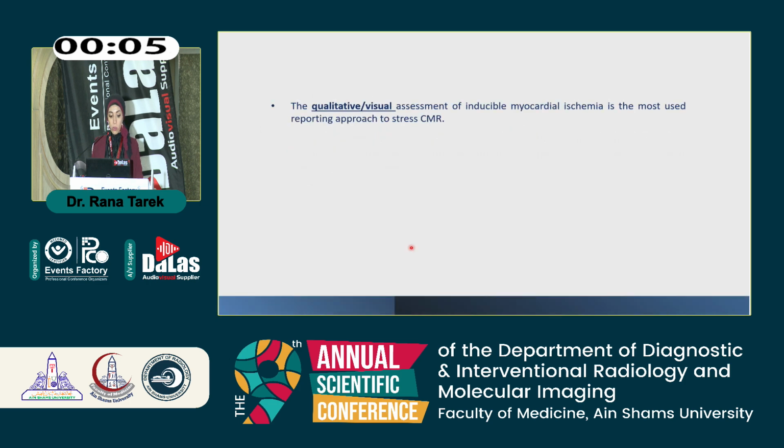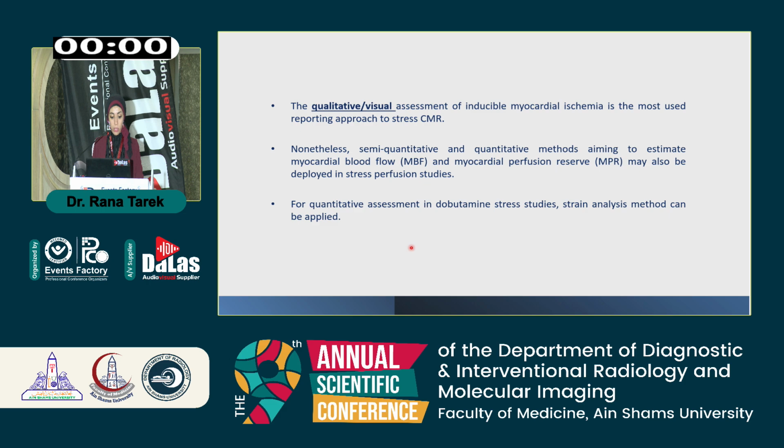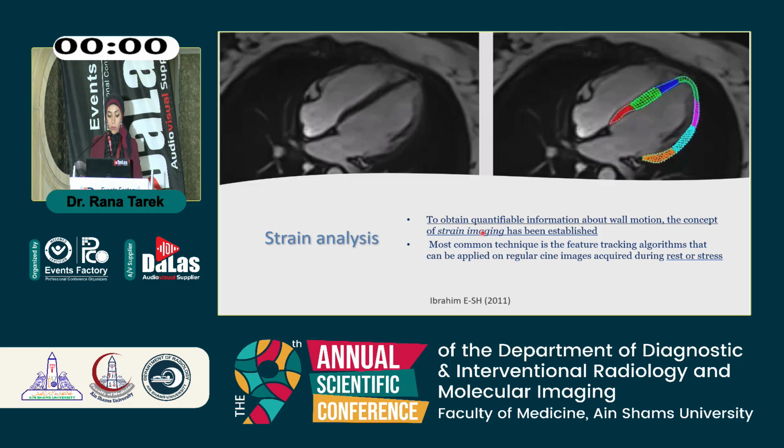We usually depend on the visual assessment. However, there are other semi-quantitative and quantitative methods for the perfusion imaging. And for the dobutamine stress studies, we can rely on the strain analysis for a more quantitative method. I will finish in 2 minutes.